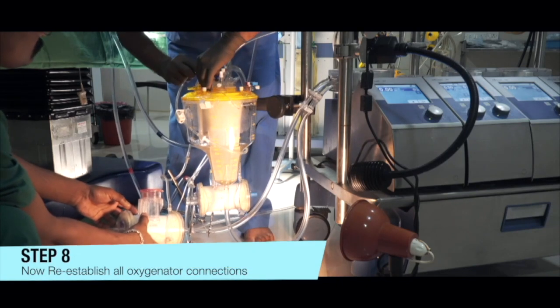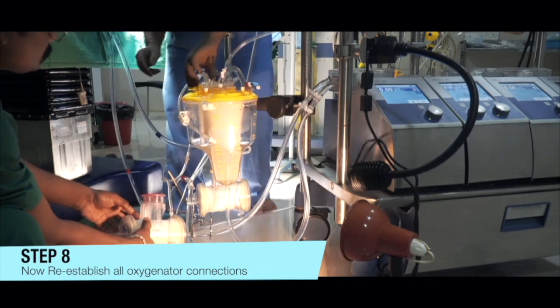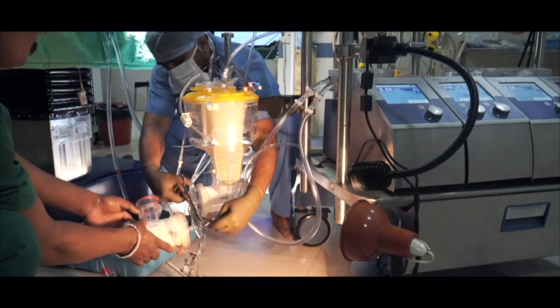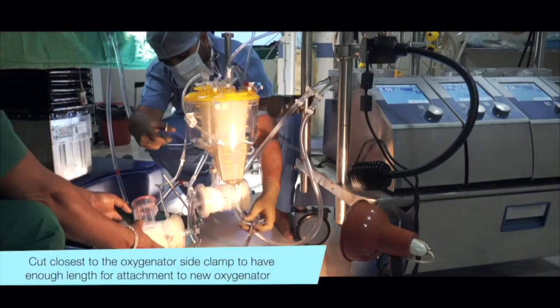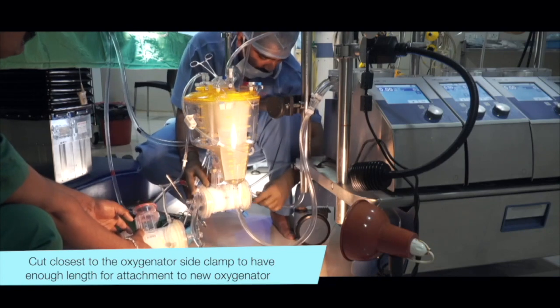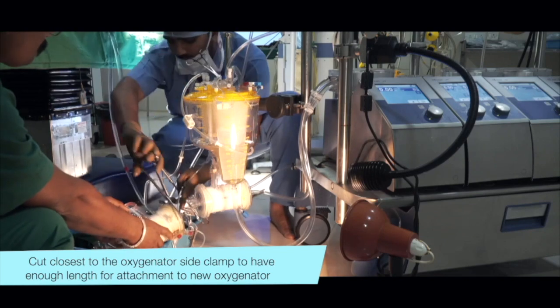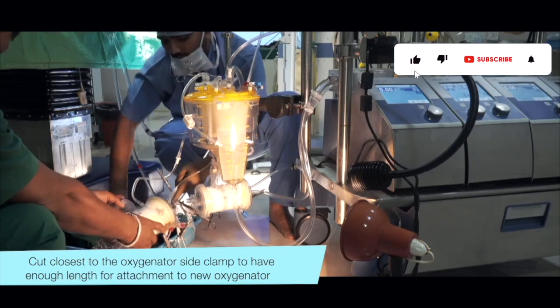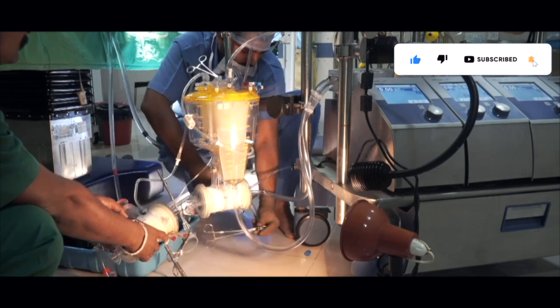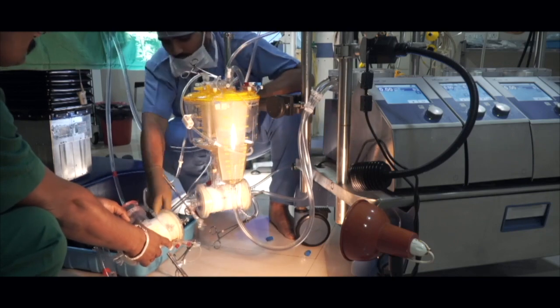Now I am going to establish all the oxygenator connections. The sequence is like this. First I will connect the oxygen gas line, then the oxygenator inlet, then the oxygenator outlet and purge line. And the most important thing is this: cut the oxygenator inlet and outlet closest to the oxygenator side to have enough length for attachment of the new oxygenator.